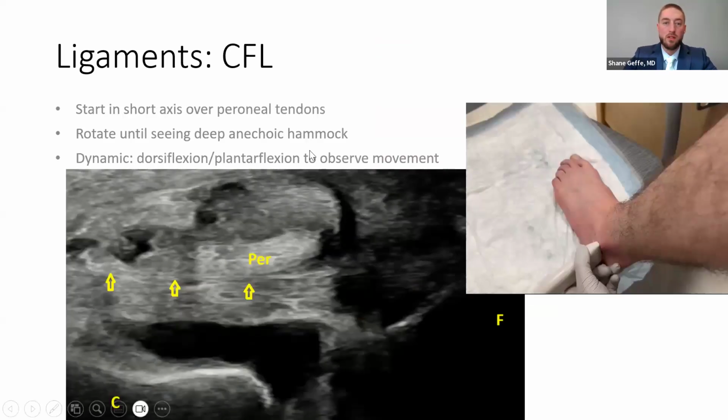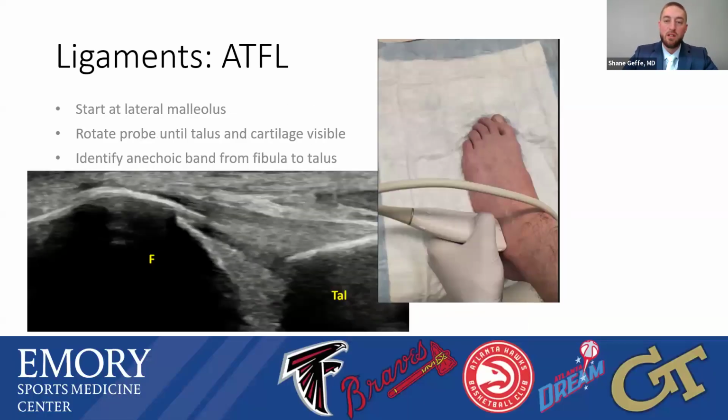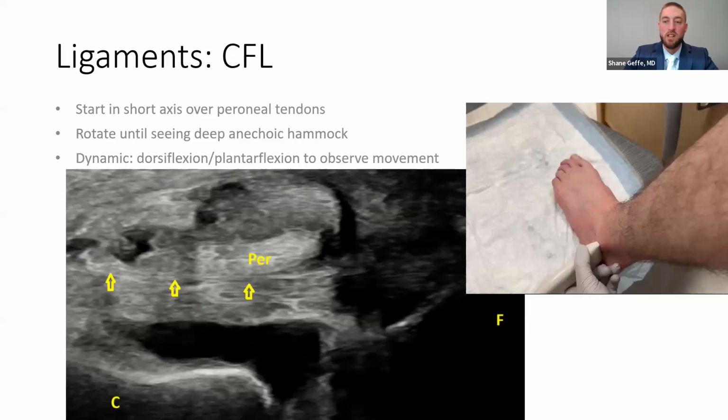The calcaneofibular ligament is a different orientation. You know, people talk about the numbers on the clock and trying to systematically go about the lateral ankle. I think that becomes confusing, but maybe that's just me, because depending on which foot you're looking at, the numbers change. At any rate, when you're looking at the ATFL, it's much more horizontally and parallel to the metatarsals. And when you're looking at the CFL, it's much more vertically.